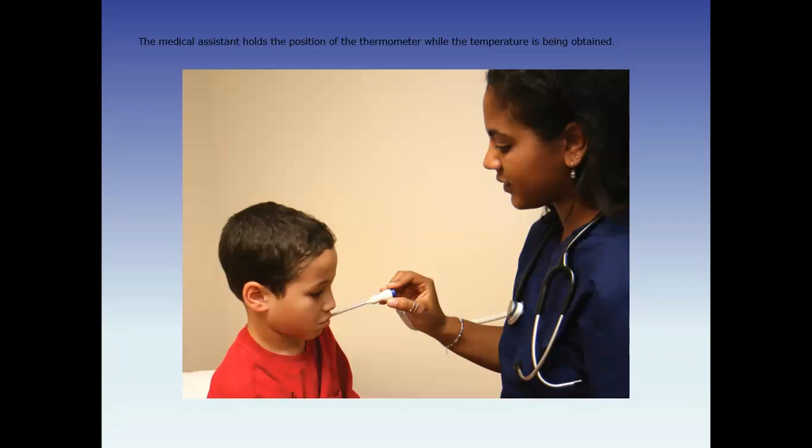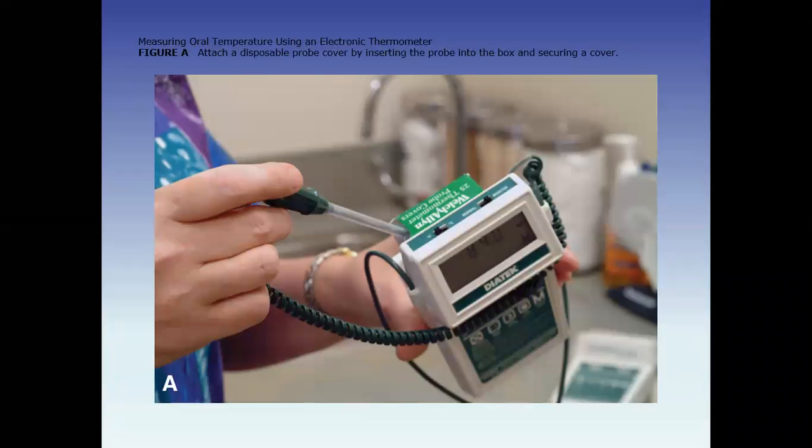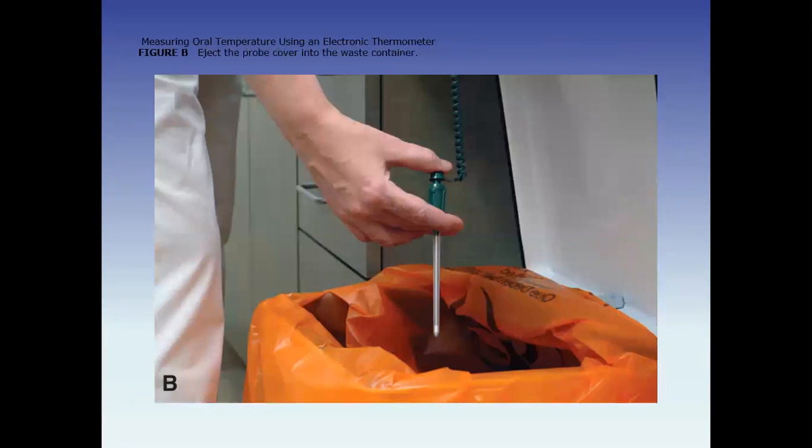This is an example of how a medical assistant holds the thermometer in position while the temperature is being obtained. Another example is the oral temperature using an electric thermometer. It attaches to a box behind it that has a lot of probe covers, where you can use them orally or axillary.